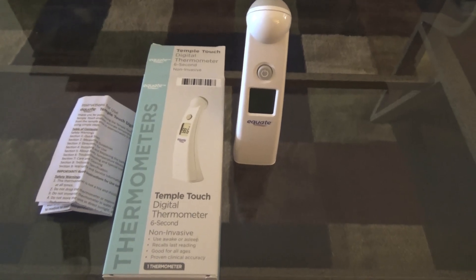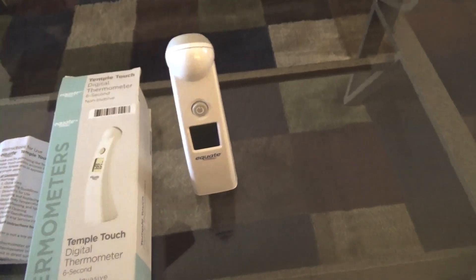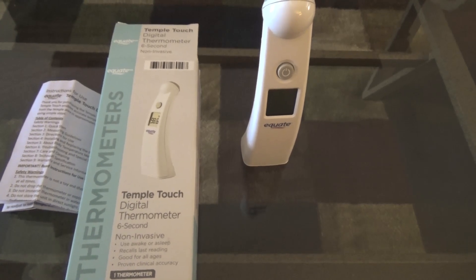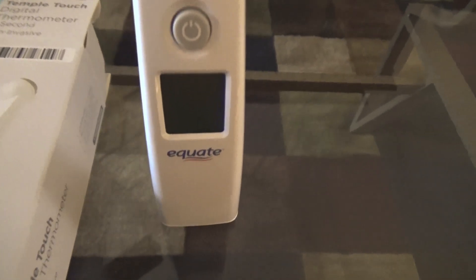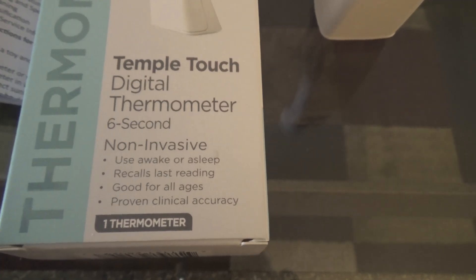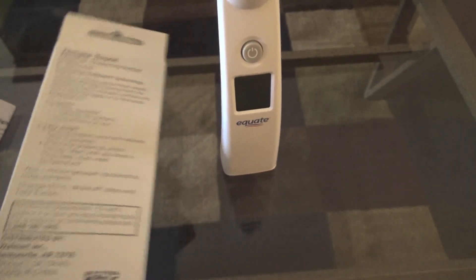They didn't have any kind of oral thermometer, so this one's a temple touch — you point it to the temple on your forehead. It's got an interesting sensor that you touch to your forehead and it takes your temperature in about six seconds. The price was reasonable: twelve dollars eighty-eight cents. Be careful — don't buy these on infamous websites on the internet, because I've seen people charging as much as one hundred dollars for the same exact Equate thermometer. Anyway, it's non-invasive, you can use it awake or asleep, it recalls the last reading, it's good for all ages, and it's proven clinically accurate.